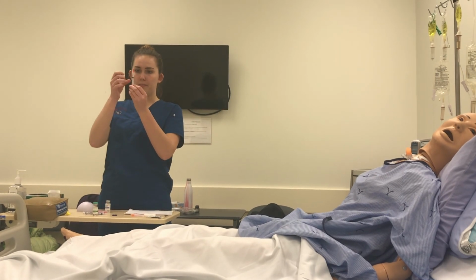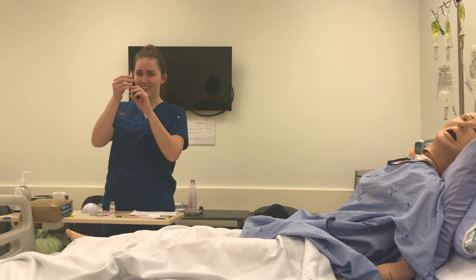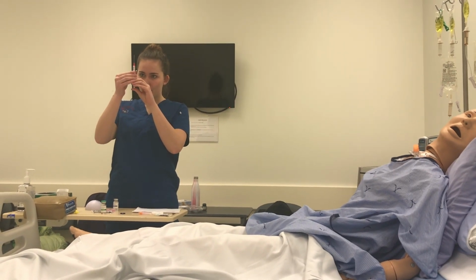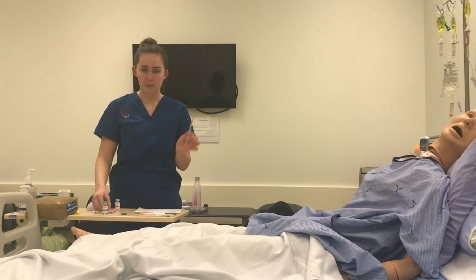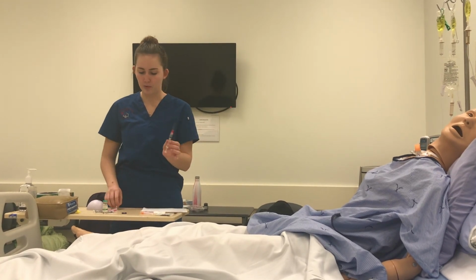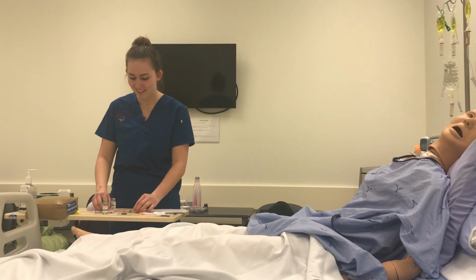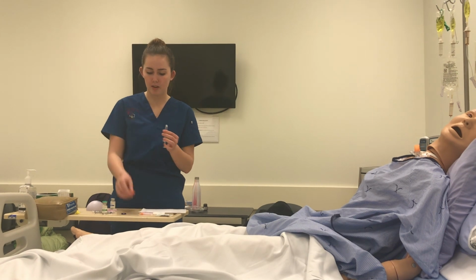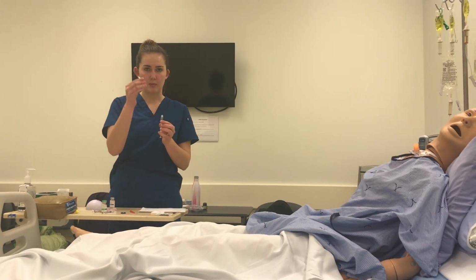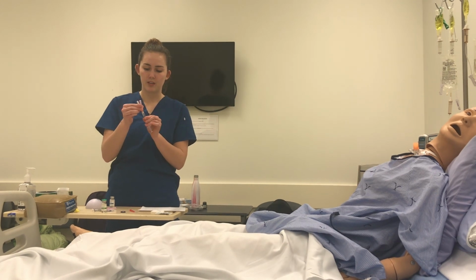I'm going to get rid of any bubbles. And okay. Now, for the purpose of this video, I'm going to recap the blunt needle, and twist it off and replace it with the 25 gauge subcutaneous needle.